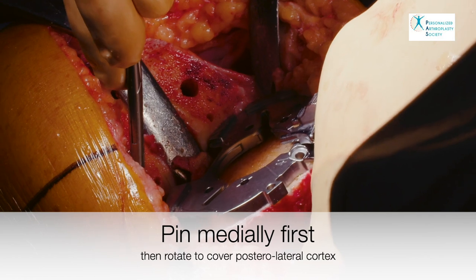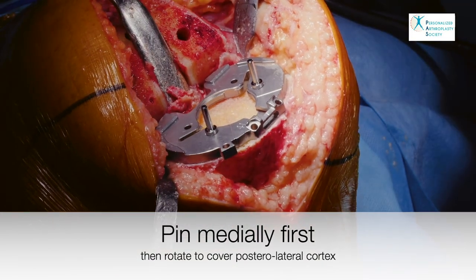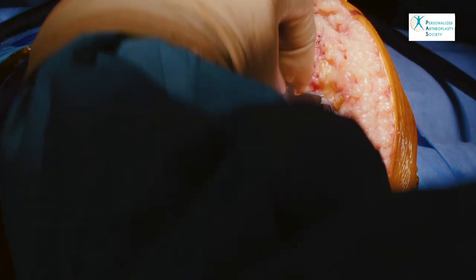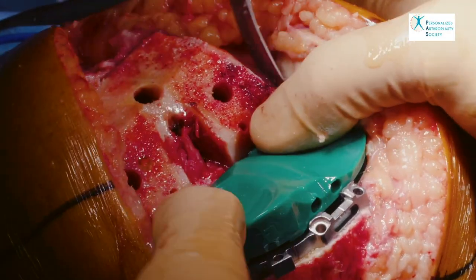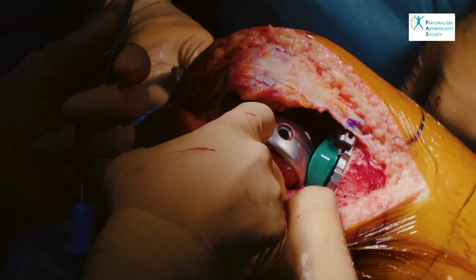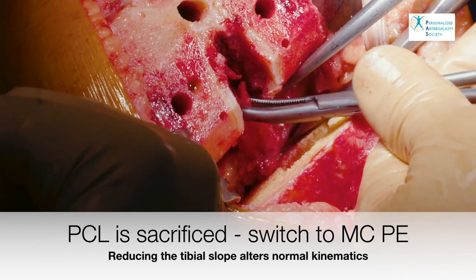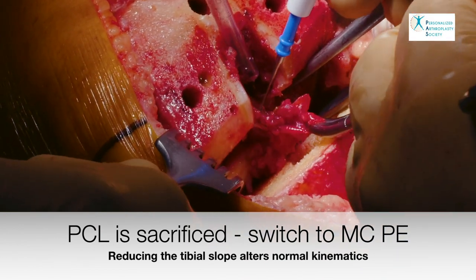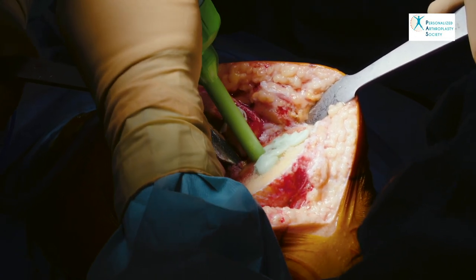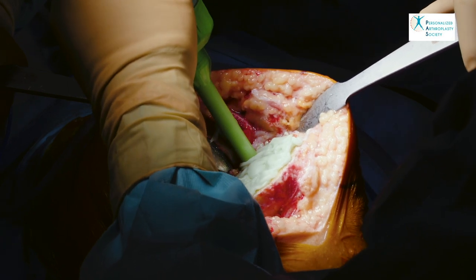The tibia is then sized and positioned appropriately. We believe that with a medial pivot design implant that favors posterolateral rollback, it is particularly important to obtain adequate coverage of the posterolateral cortex. The restoration of the physiological laxity of the medial compartment is confirmed by feeling the MCL is lax in a resting position and taut when stressed. We proceed with cementation. Cement is pressurized into the tibia in a posterior to anterior fashion to avoid bone marrow seeping under the nozzle of the cement gun.